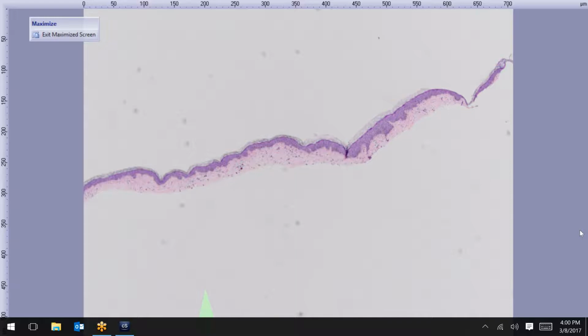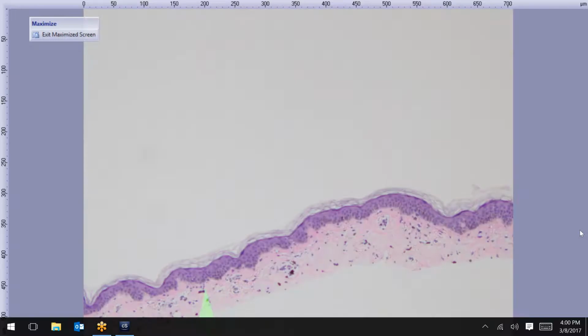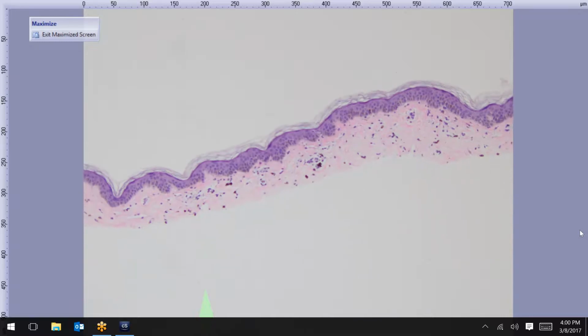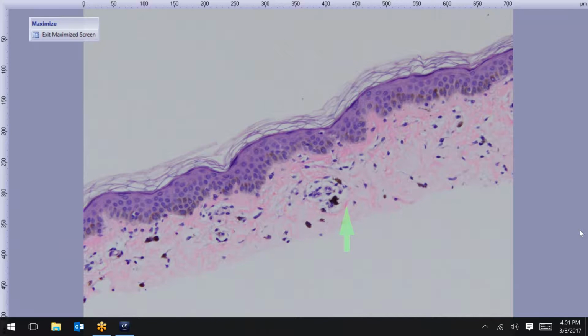Okay. This was one we received recently, and the patient had numerous truncal, brand new hyperpigmented patches all over. So this biopsy was performed, and you see the deposits of pigment in the upper dermis. These are all melanophages here, right here, here, here.